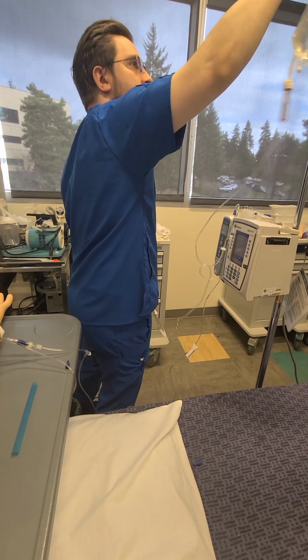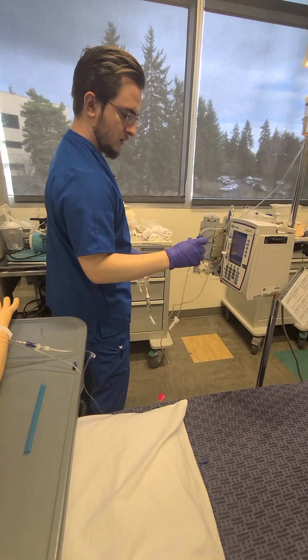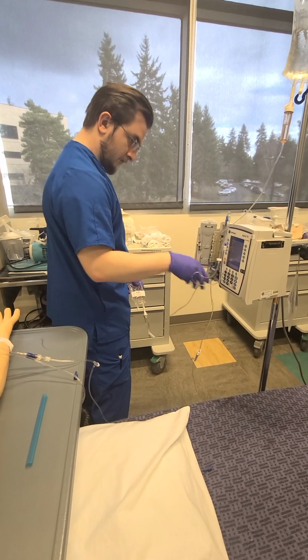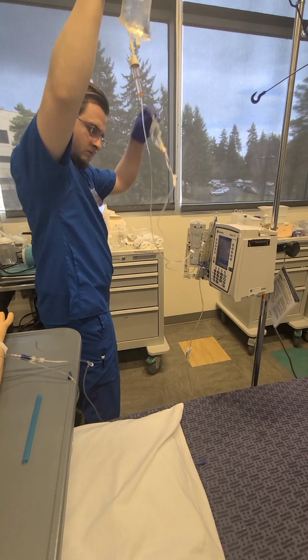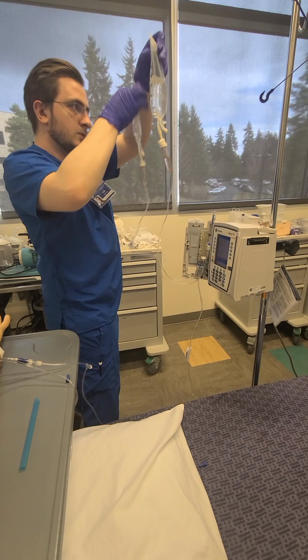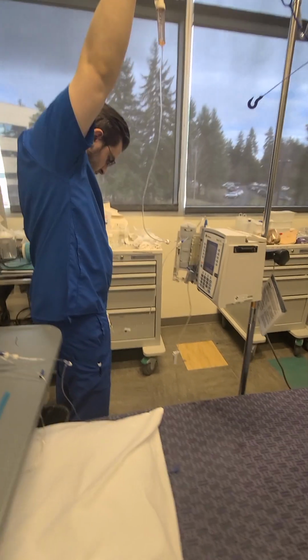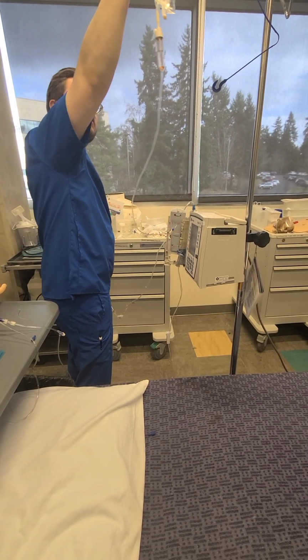Hold on. Let's just take this out here real quick. Flip this so we don't spill. Go ahead and spike my bag. Fill chamber halfway. Maybe there's a kink right there. That's why. And make sure to unclamp my line and clear it of any bubbles. Just really doing this slowly.